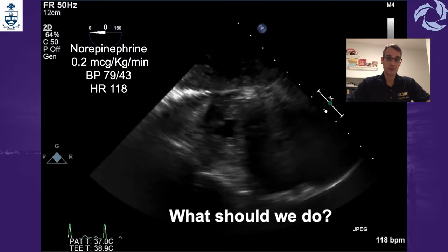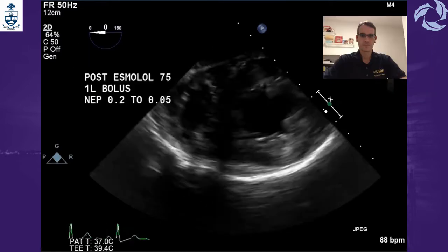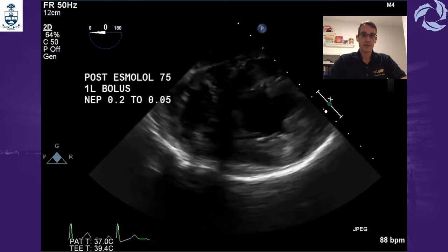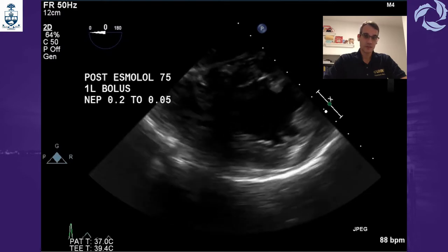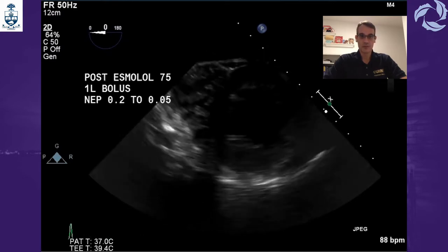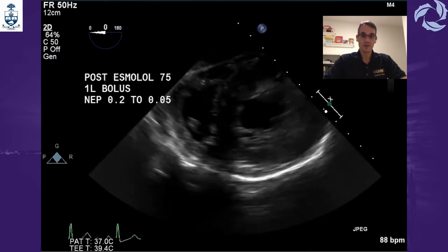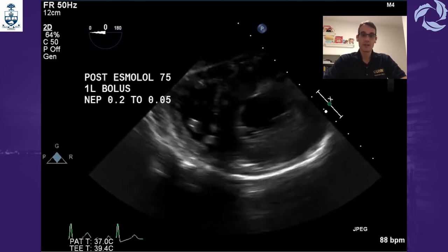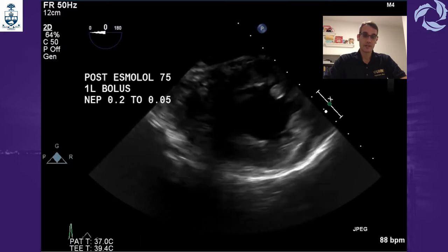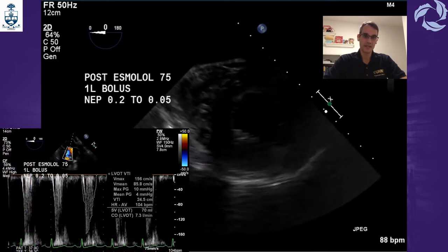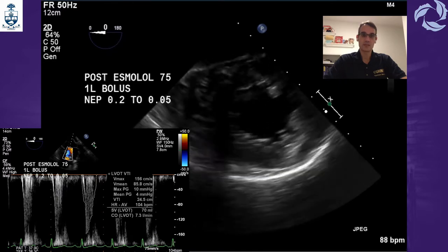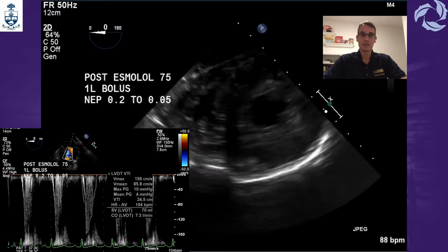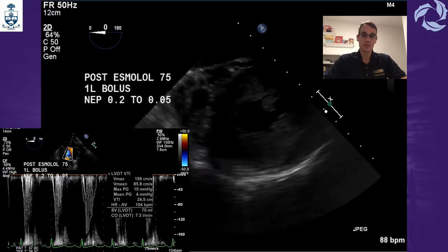So what should we do? We approached the anesthetic team and recommended giving a bolus of esmolol plus one liter of fluid. We were able to reduce the norepinephrine from 0.2 to 0.05 with adequate pressure. As you can see in that image, the left ventricle is not so hyperdynamic now — it's not so empty, and it's working much better.